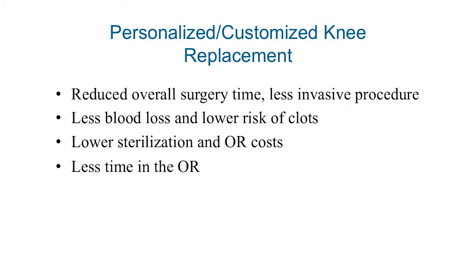It reduces the surgery time, there's less blood loss, hopefully a lower risk of clots because we're not putting that rod up the femur. It's a cheaper system because we're not sterilising all those metal trays.